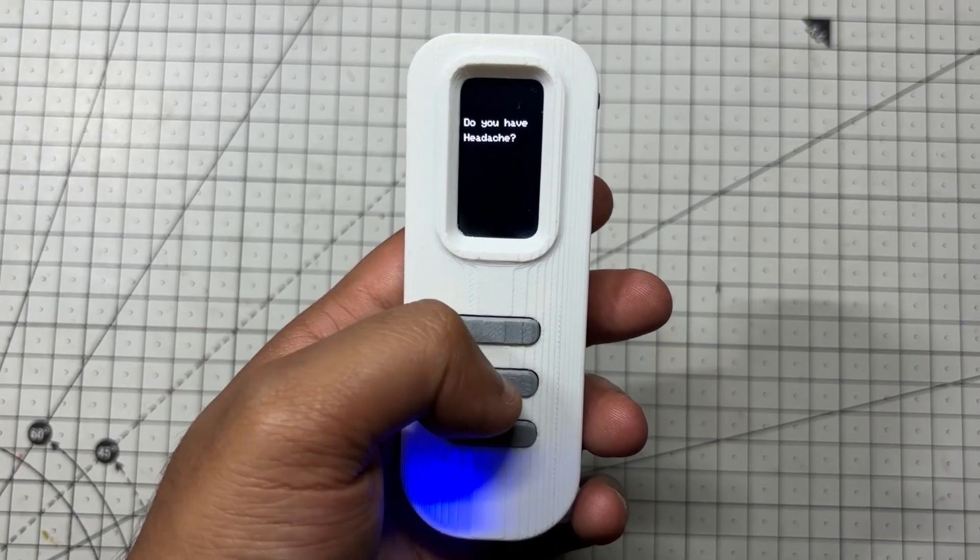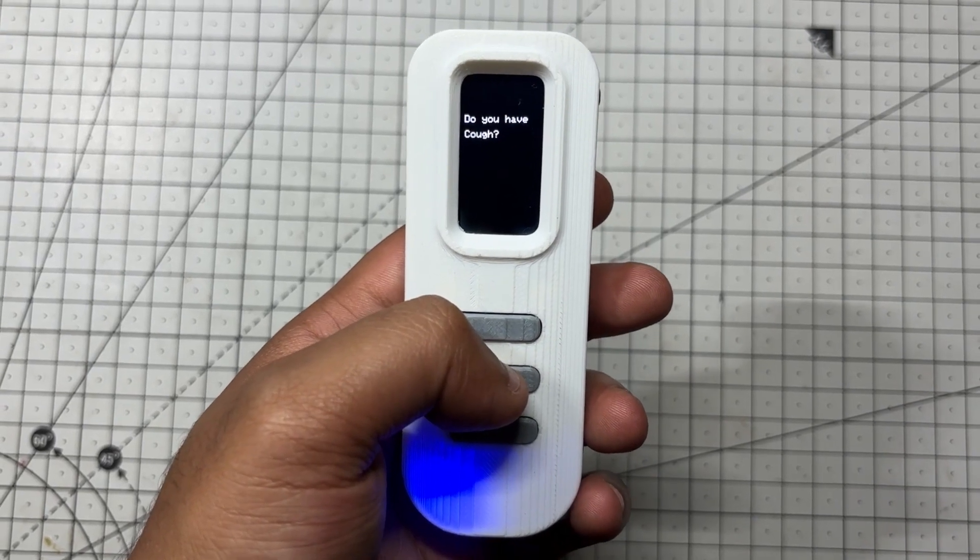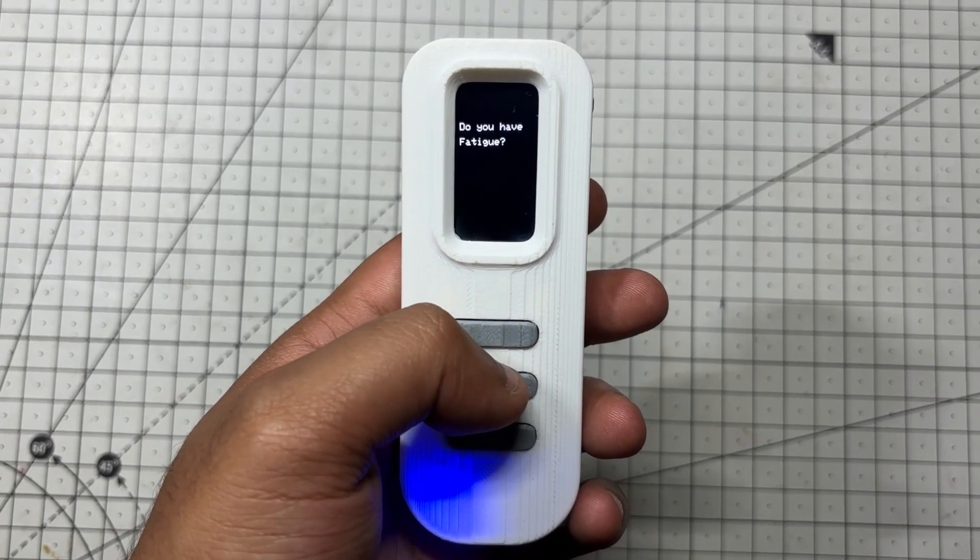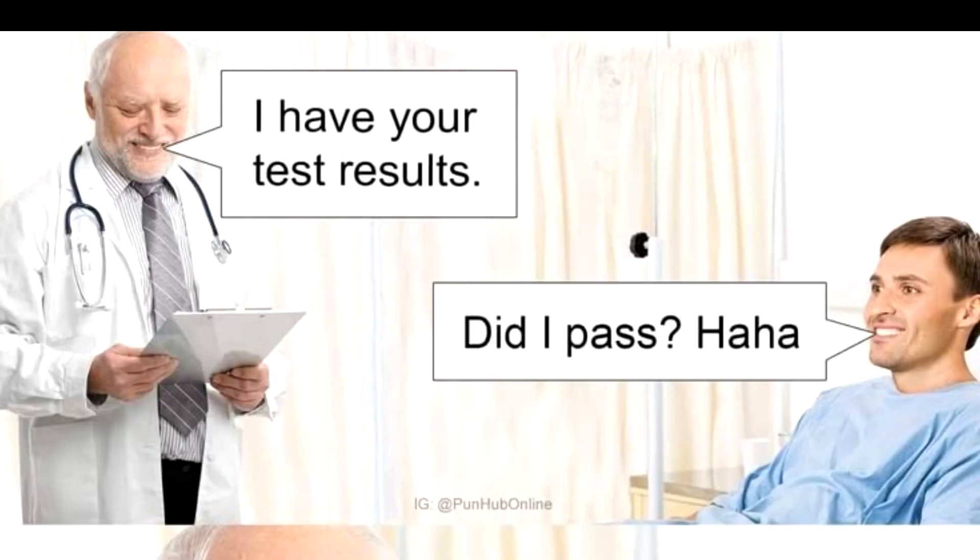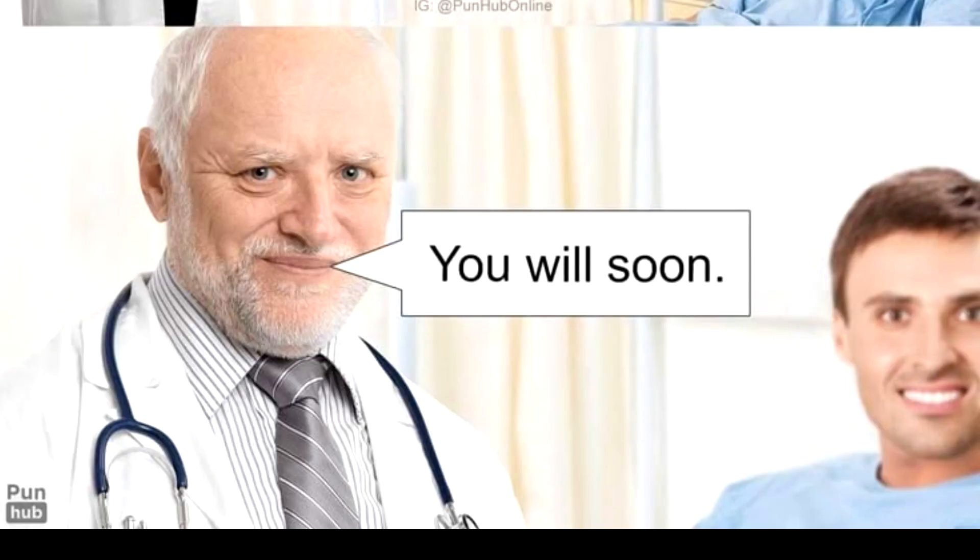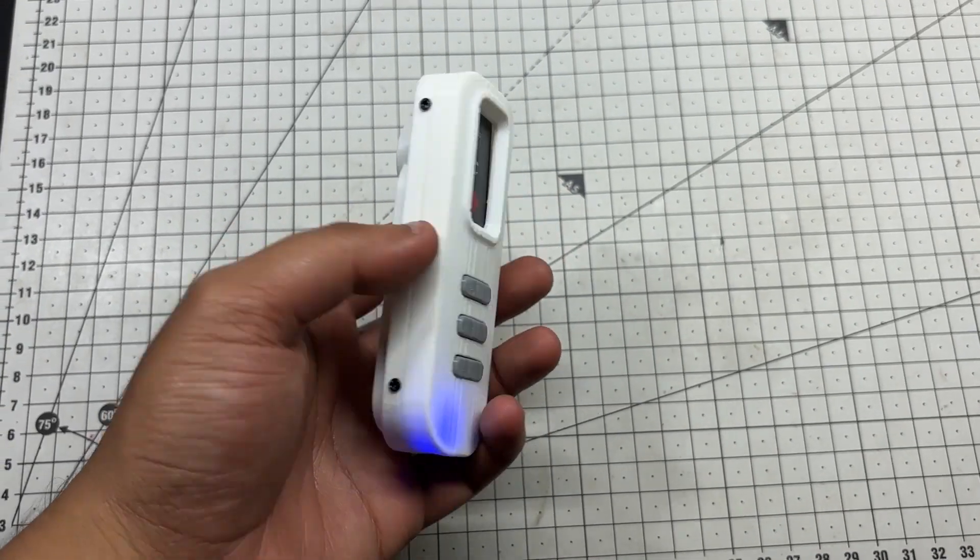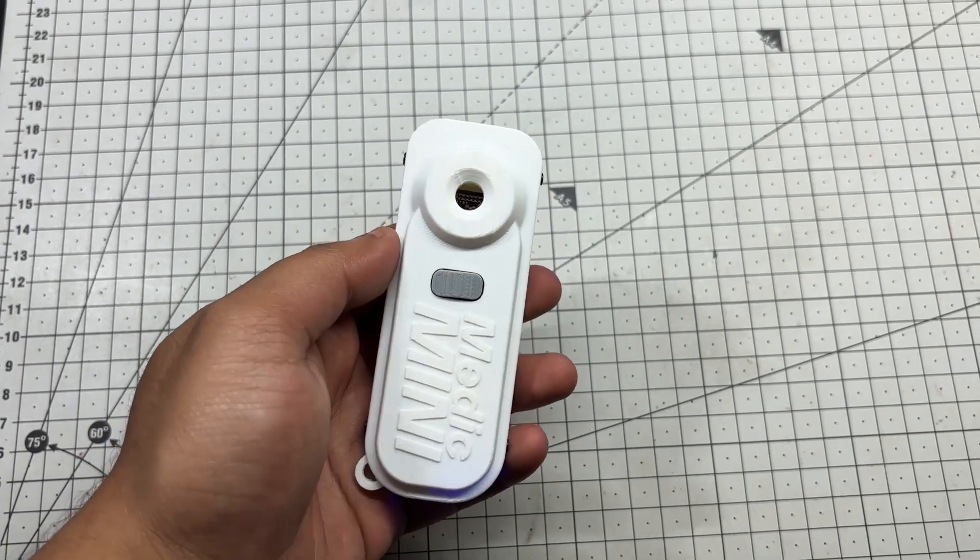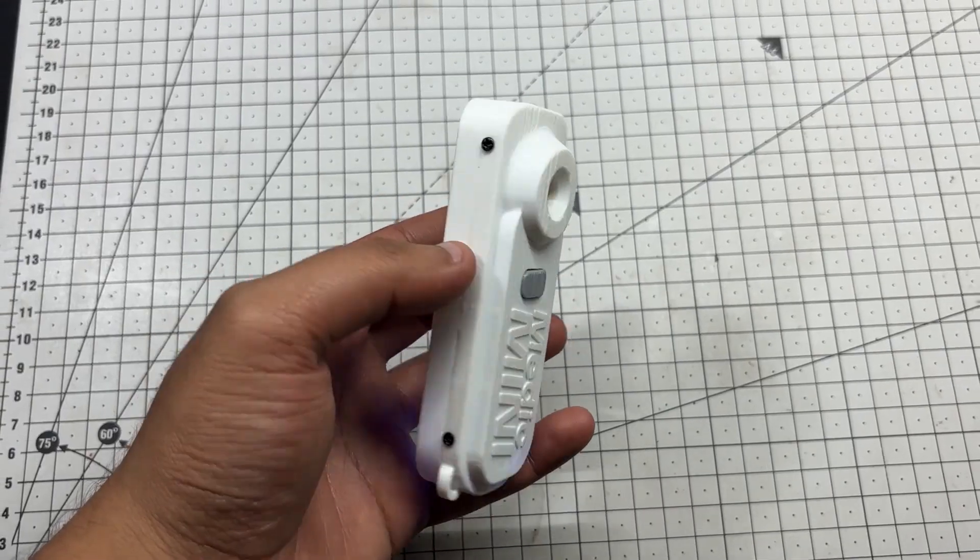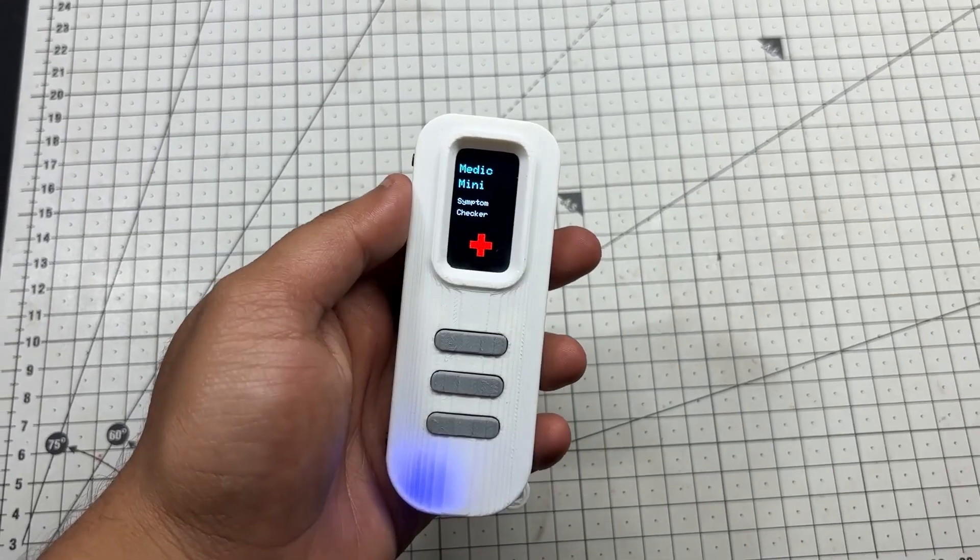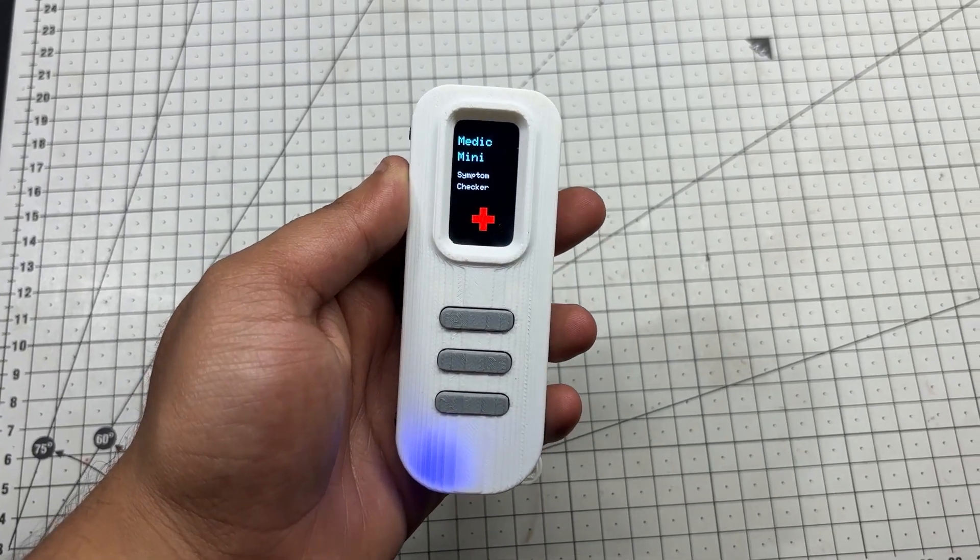I plan to expand its diagnostic database by collecting more symptom data and working with medical professionals to refine the logic. Based on the pattern of responses, this device offers a basic diagnostic suggestion, making health checking feel as simple as flipping a switch.